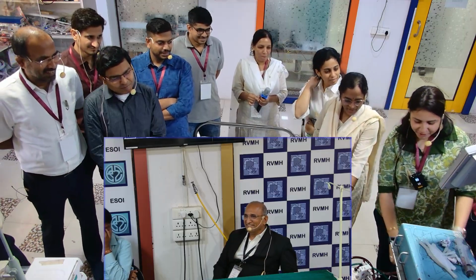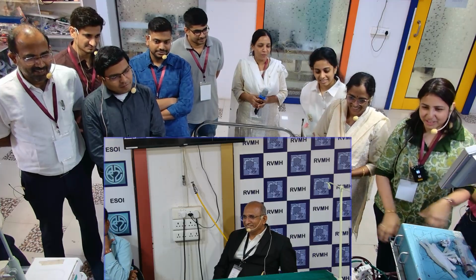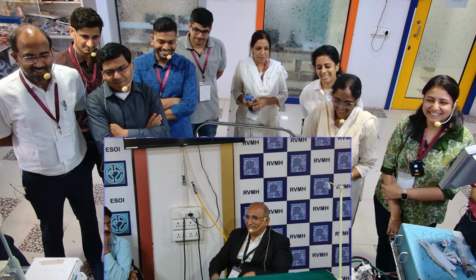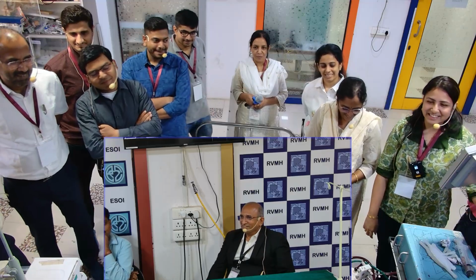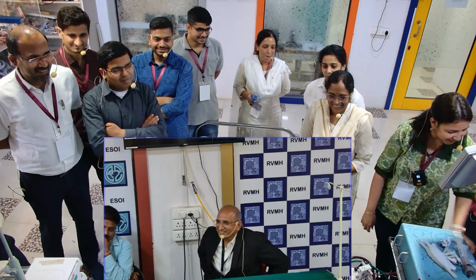We thought that when we changed the connection, we changed everything. That is where we got confused. We thought this entire part was already changed. No, the filter wasn't changed. I was about to modify everything, then I got up and saw whether she had changed the filter or not, and she had not changed the filter. She had changed everything else. Sir, the cylinder also has no gas, so I got confused whether the cylinder needed changing again.